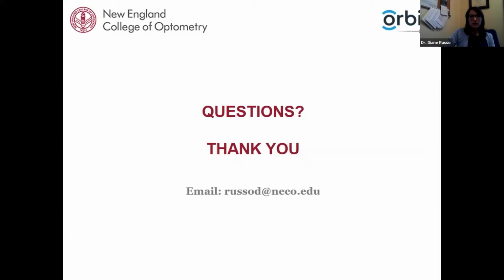The next question is, do you always trust the autorefractor or do retinoscopy for every patient you have? Some of this will depend on the age of the patient. For younger patients, for the pediatric population, I'm more likely to rely on the retinoscopy findings. I think there's evidence to show that the pediatric patient population is more likely to over-accommodate when they're in an autorefractor. And so in that case, I may more commonly perform retinoscopy, whereas the adult population that I work with, I very commonly will use the autorefractor.